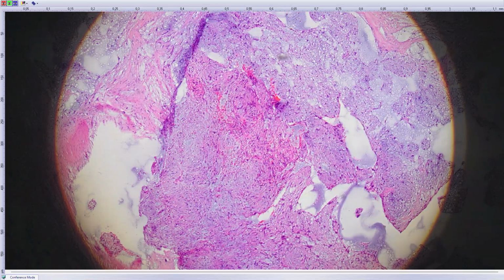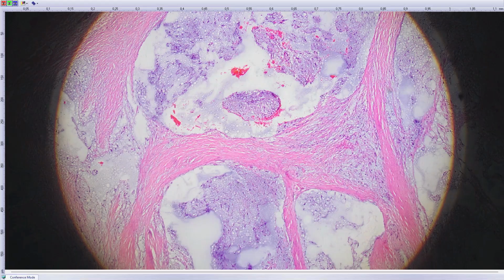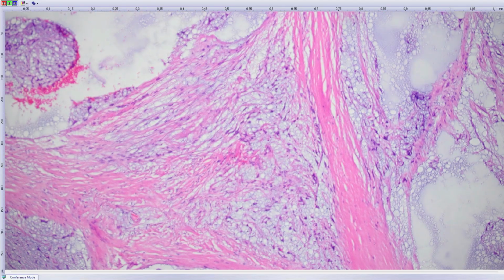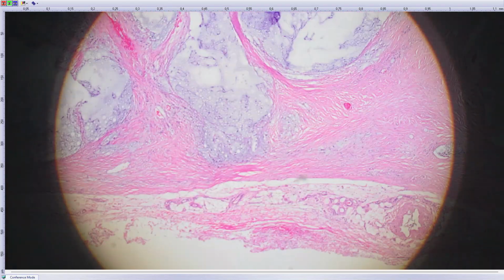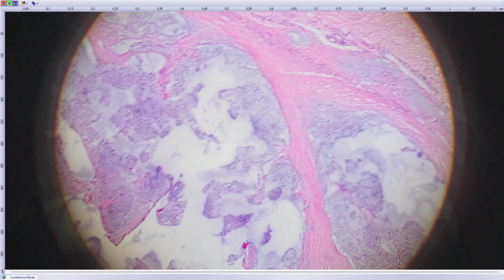And so you can form some differential diagnosis. So this could be some myxoid neurogenic tumor, perhaps. The clue is again this interlobular, more solid proliferations. Perhaps extraskeletal myxoid chondrosarcoma could look like this as well. And perhaps intramuscular myxoma, but this is not intramuscular really. So maybe cutaneous myxoma, but somewhat multicellular.